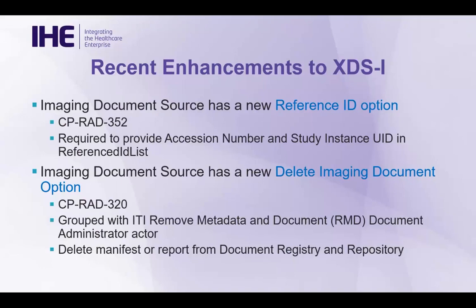We choose the delete option. That means with this delete imaging document option, both the metadata and the document will be deleted from the registry and the repository. And it can handle both the manifest and the report.